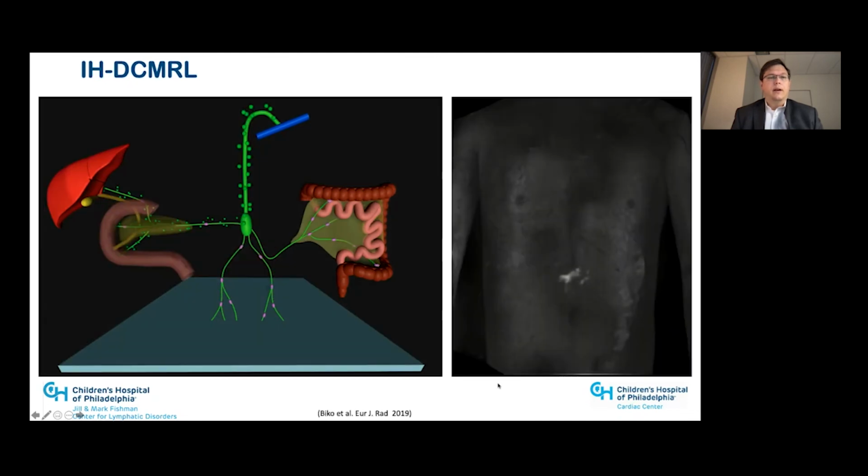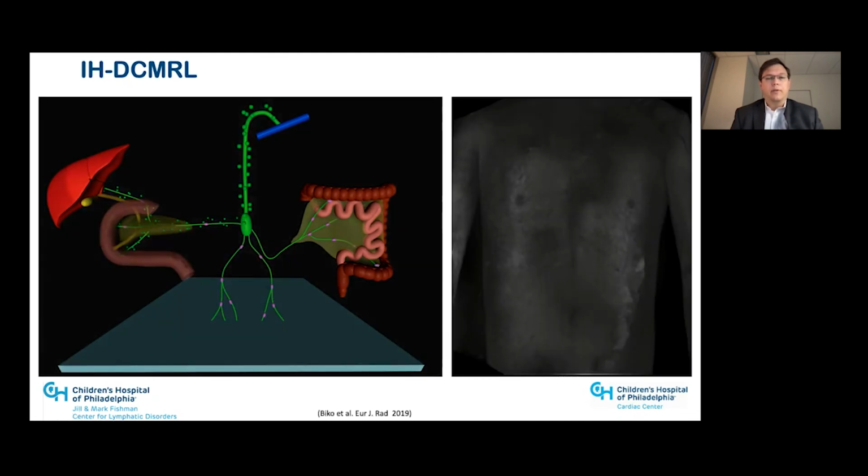The intrahepatic injections are very similar. As the liver lymphatics exit the hilum of the liver, they coalesce centrally around some para-aortic and parasplenic pancreatic lymph nodes, and ultimately connect again to the cisterna chyli and opacify the distal thoracic duct as well.